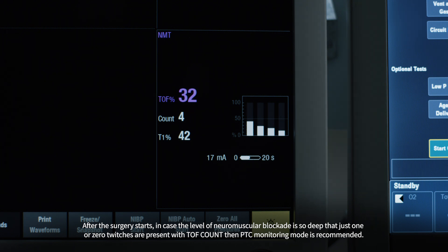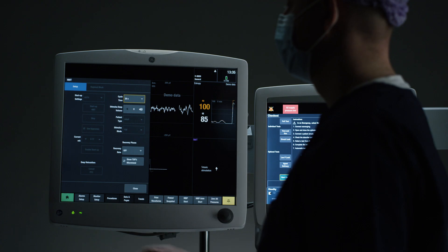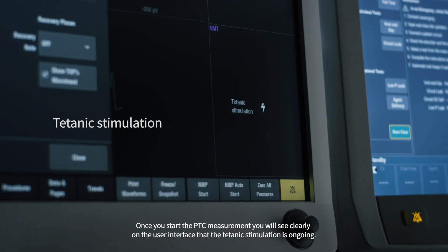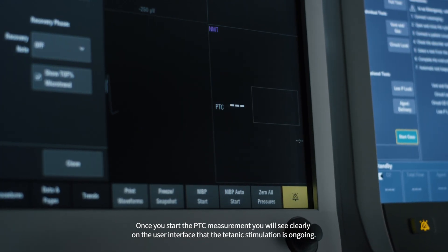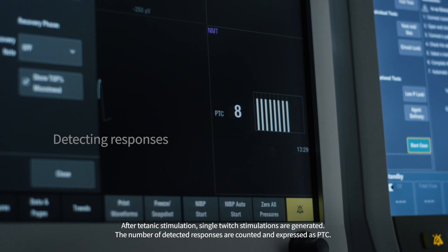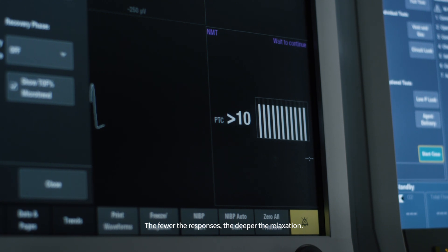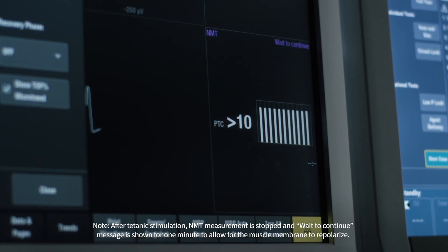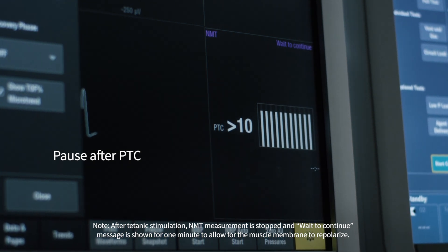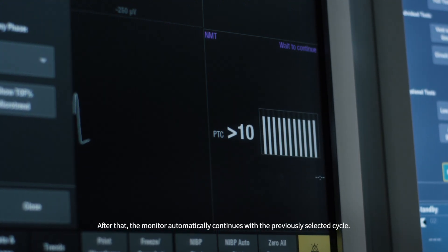After surgery starts, if the level of neuromuscular blockade is so deep that just one or zero twitches are present with TOF count, using post-tetanic count (PTC) monitoring mode is recommended. Once you start the PTC measurement, you will clearly see on the user interface that the tetanic stimulation is ongoing. After tetanic stimulation, single twitch stimulations are generated. The number of detected responses are counted and expressed as PTC — the fewer the responses, the deeper the relaxation. After tetanic stimulation, NMT measurement is stopped and a wait-to-continue message is shown for one minute to allow the muscle membrane to repolarize, after which the monitor automatically continues with the previously selected cycle.